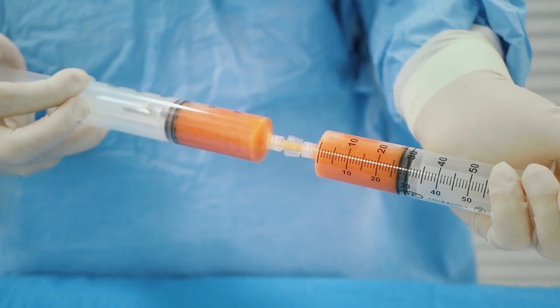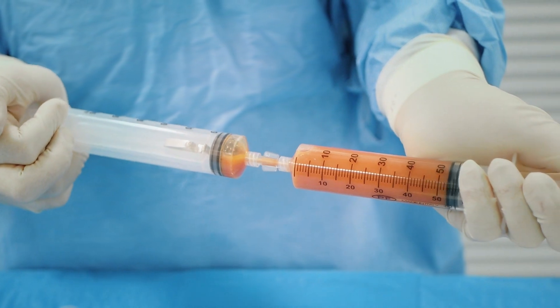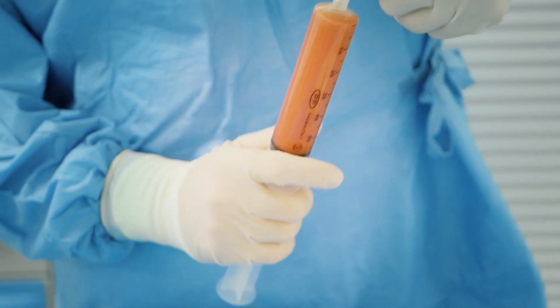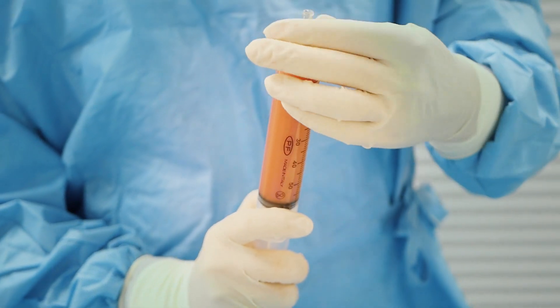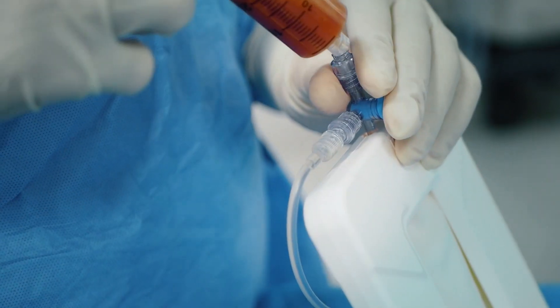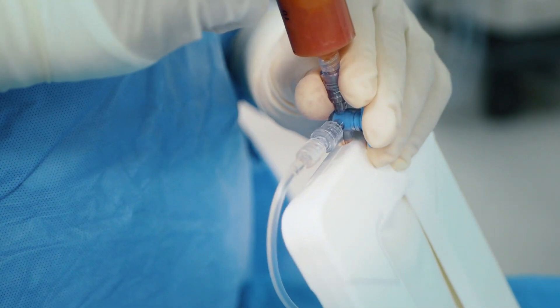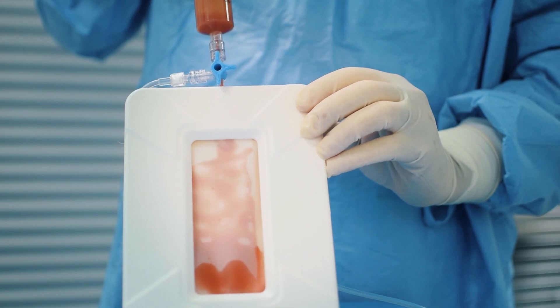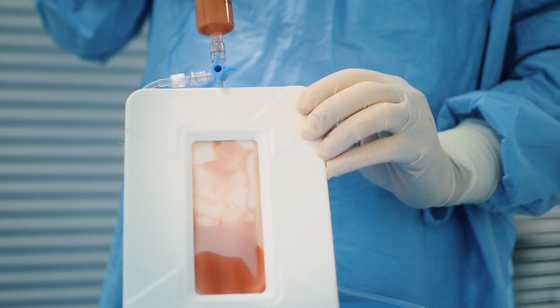Lipoaspirate can be transferred to a new syringe to test the presence of fibrous fragments. If those are present, remove them before starting the processing. Connect the lipoaspirate to a washing bag with a minimum volume of 500 ml hanging from a stand. Ringer Lactate is highly recommended as the washing solution.